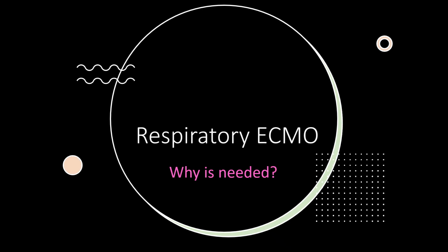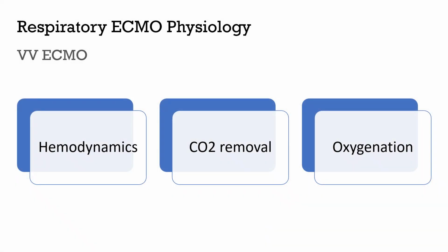Respiratory ECMO, why is it needed? ECMO physiology. I think all of us agree that CO2 removal and oxygenation are the role of ECMO. But does veno-venous ECMO support the hemodynamics? Will the patient who has veno-venous ECMO have supported or enhanced hemodynamics? This is an important question that should be answered.